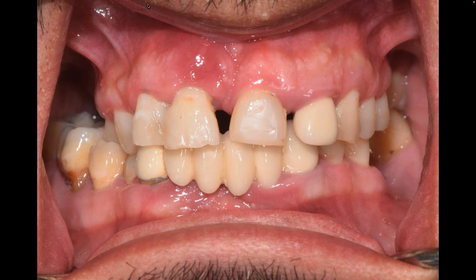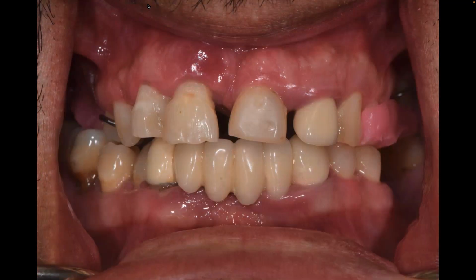This is how the patient bites in MIP. This is how the patient is in CR. Did you see that shift? This is how the patient is in CR. And in CR, the incisal embrasure between 24 and 25 does coincide with the patient's facial midline, which you cannot see. But again, it coincides with the labial frenum in this case.